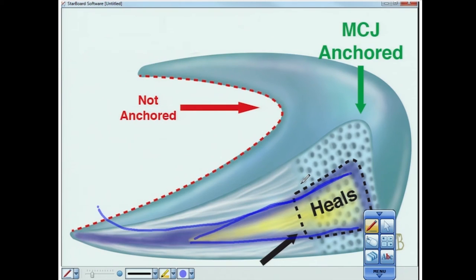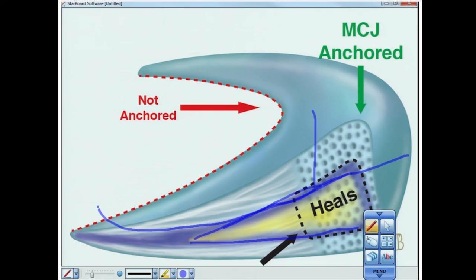The bunny ears should be relatively faint. They should never be equal to or brighter than hyaline cartilage. They should never go all the way back to the capsule. They should never go up and down. They should never have complex character. They should have exactly this gently sloping character.